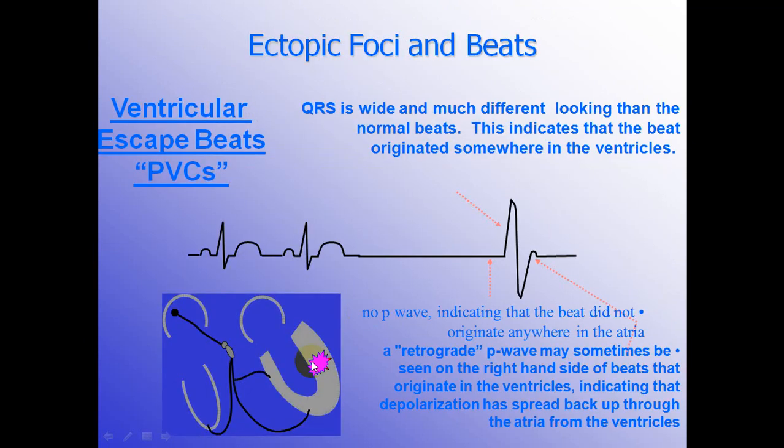So this originated in the ventricle, that's why the depolarization and activation in the ventricle. And this is the bizarre QRS complex. No P wave, either buried there or there. And the wide QRS complex and the ST-T wave in different polarity, opposite polarity to the R wave.